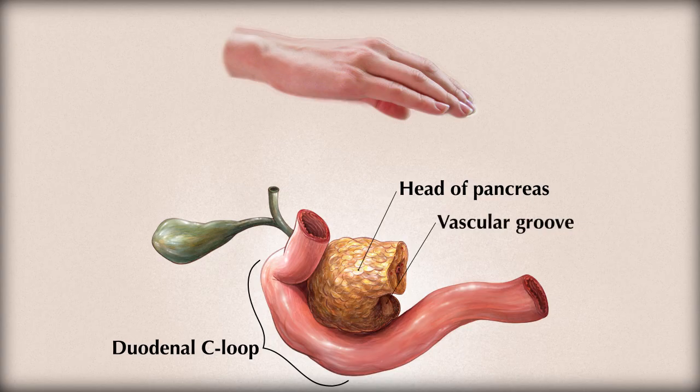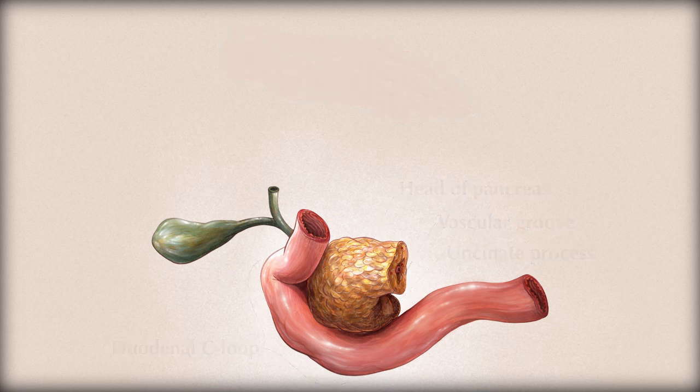The vascular groove, an impression left by the superior mesenteric vein, is smooth and corresponds to the recess between the thumb and index finger. The uncinate process corresponds to the tip of the thumb and typically appears tattered and cauterized compared to the more lobular head of the pancreas.